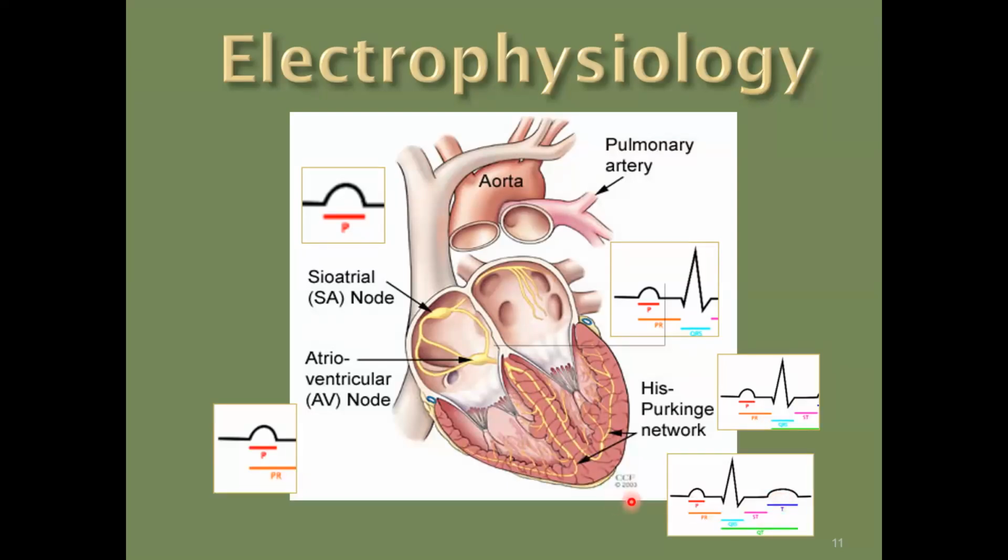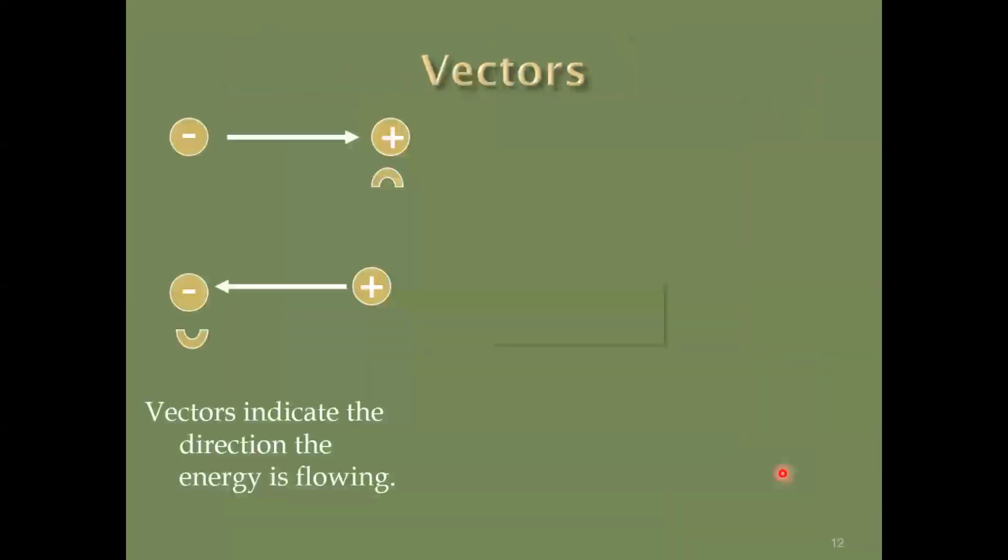So when you're looking at the total amount, you've got your P wave here, your PR segment, that's when the AV node is holding onto the impulse, your QRS complex, that's ventricular depolarization. Now, during ventricular depolarization, you have atrial repolarization. You just don't see it because the waveform is so small and it's obscured by the large QRS of the ventricles depolarizing. Here's your ST segment. We're going to talk a lot about that when we get to ischemia and injury. And then your T wave is your repolarization of your ventricles.